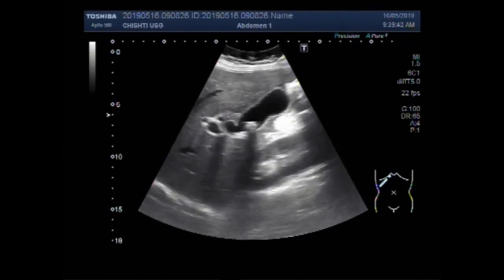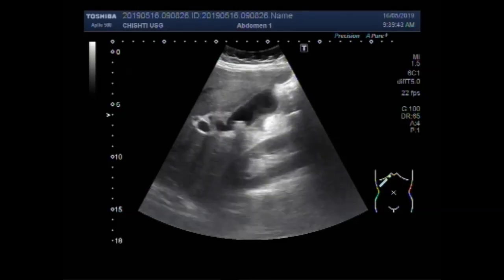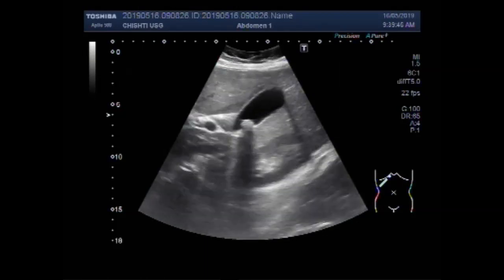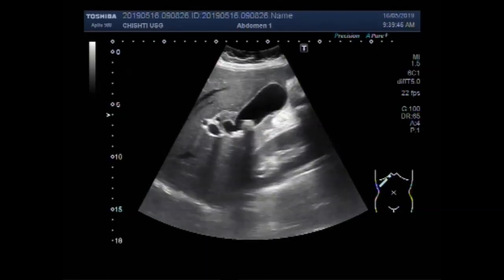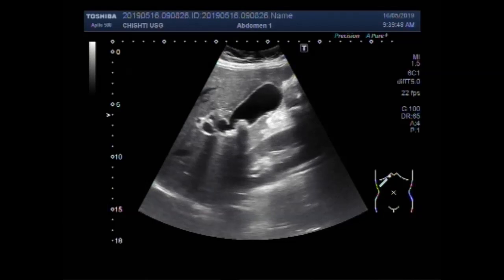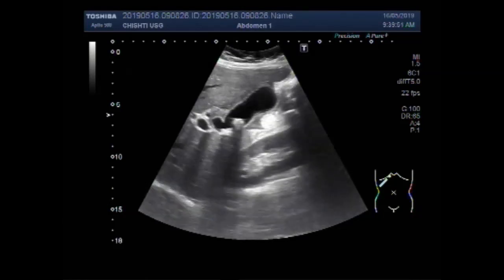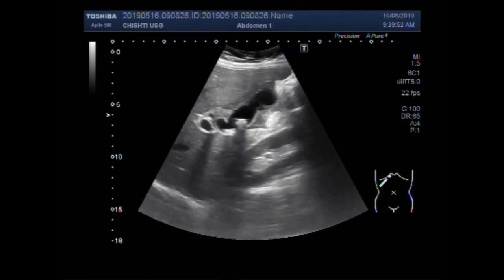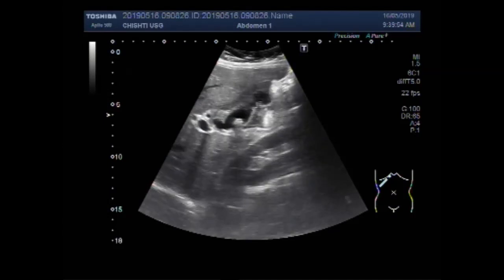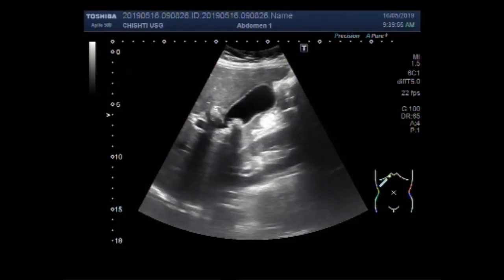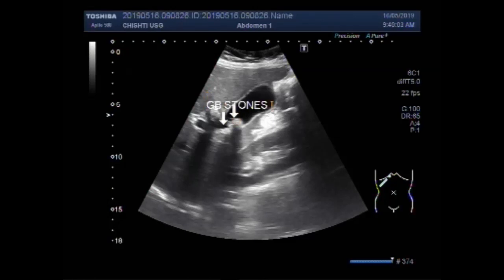You can see multiple stones lying in the body and neck of the gallbladder. The gallbladder wall is slightly thick. You can see these multiple stones in the gallbladder.